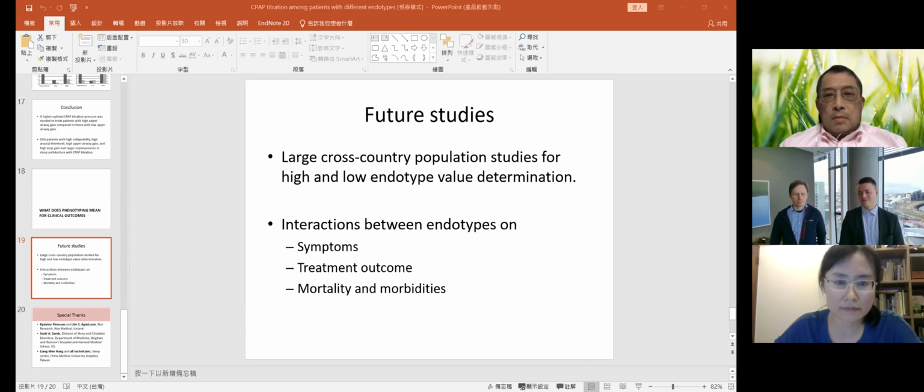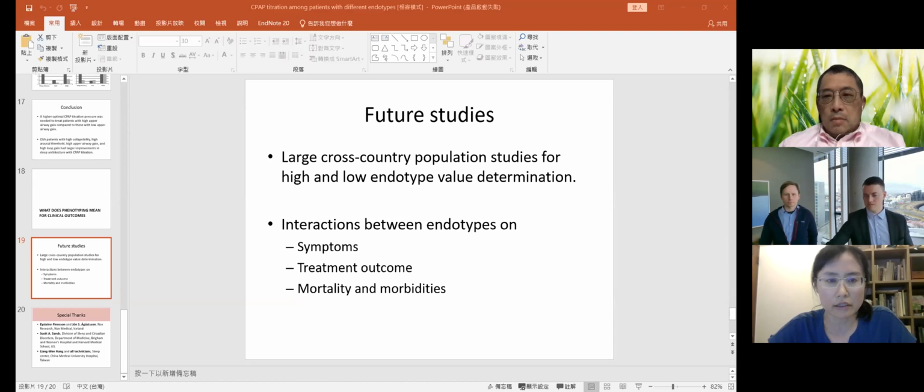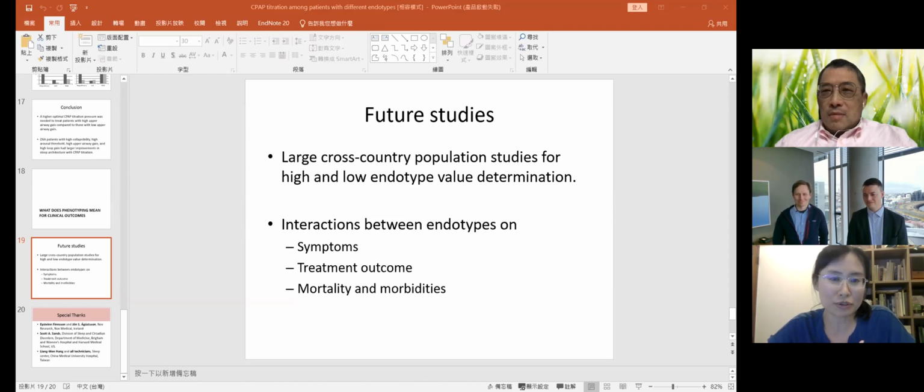You mentioned that in Taiwan, most of the studies are performed in an in-lab environment. Is that something that is going to change, in your opinion, in the coming years, or are we still far away from performing studies in the patient's home? Well, I'm also interested in whether this PUP method can be used in home PSG. In Taiwan we have national health insurance which covers almost everything, so patients come to the sleep center with almost zero pay. Everyone would choose to have a laboratory PSG. With laboratory PSG, our technicians can provide standardized practice and manually score these results, so it's perfectly suitable for the PUP method.